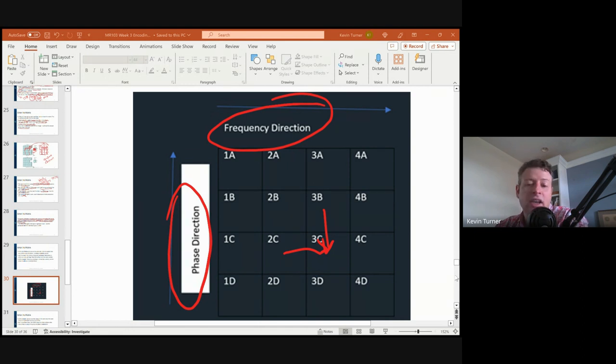And slice select is the only one that is stuck, right? If I say you're running an axial slice, which one is your phase and your frequency? I've not given you enough information to answer that question. But if I say you're running an axial, which gradient is your slice select, then it's the Z always. But just asking which one is the phase and frequency, that's not enough information to know that.